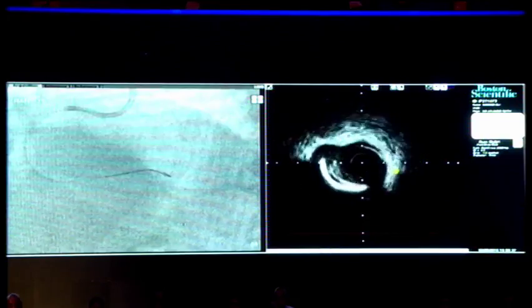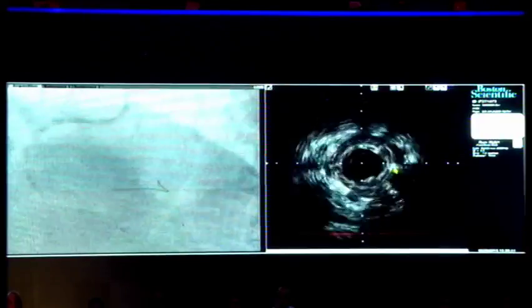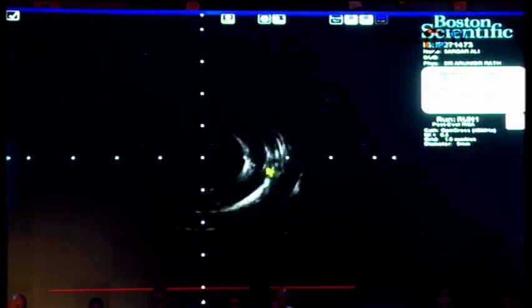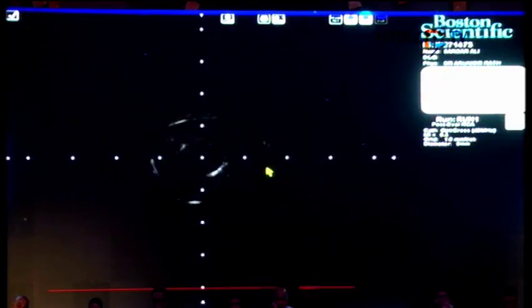Okay, that's super helpful. So, let's do the following. I'm just going to balloon it. If it doesn't work, maybe we'll just go retro. Okay, good. You guys see it? Okay, take it out. Yeah, it's out, man. It's in the guide.